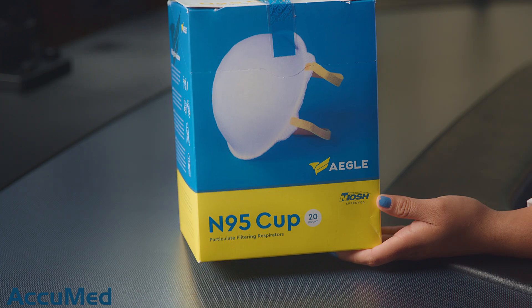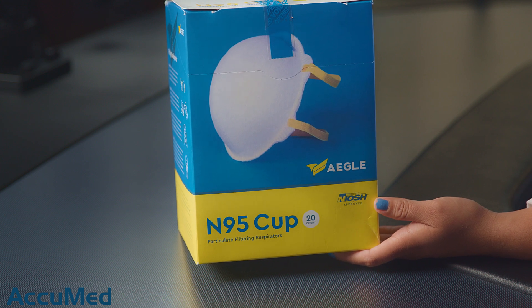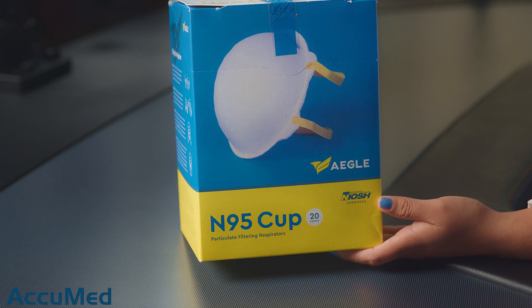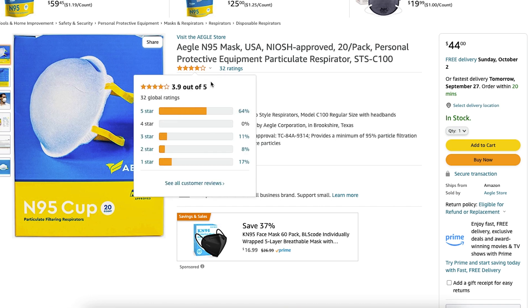Hello everyone and welcome back to the AccuMed channel. Today we're going to be reviewing the Aegle N95 cup style respirator. We recently tested their bifold style respirator, so we're really interested to see the difference in filtration efficiency and pressure drop between these two models. We purchased them from Amazon — they come in a box of 20 for $44 and have a 3.9 out of 5 rating with 32 reviews.